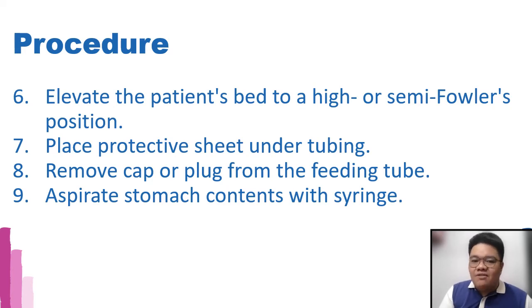Okay? So again, for the aspiration of stomach contents, if less than 100, return, and then class, you can proceed with your feeding. If more than 100, refer to the doctor before you continue the feeding.